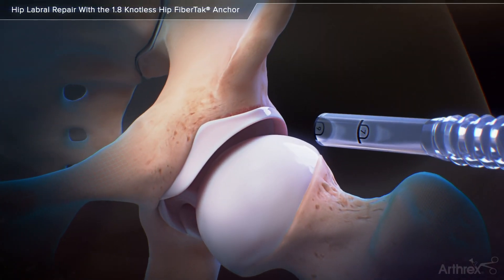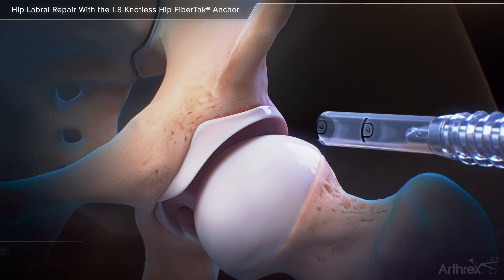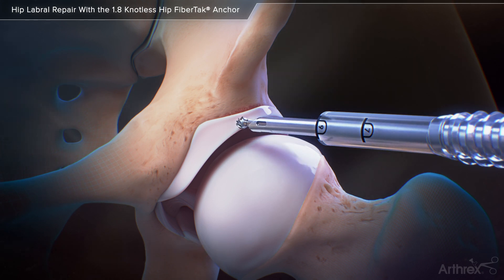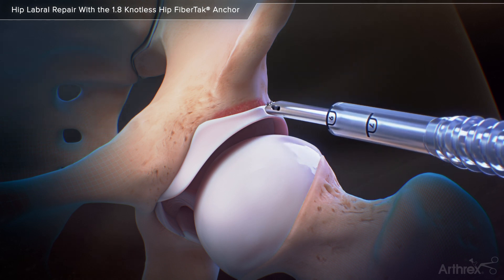Hip labral repair with the 1.8 knotless hip fiber tack anchor. Inversion stitch. Use a retractable hood burr to complete an acetabuloplasty and prepare the rim for anchor placement.